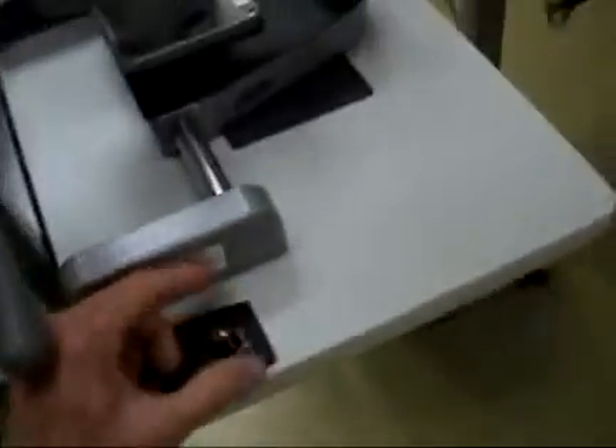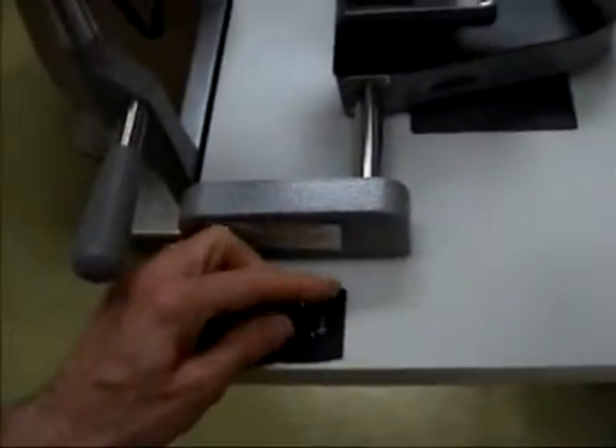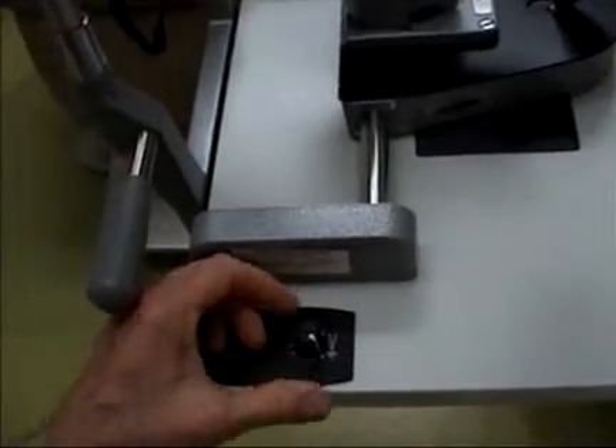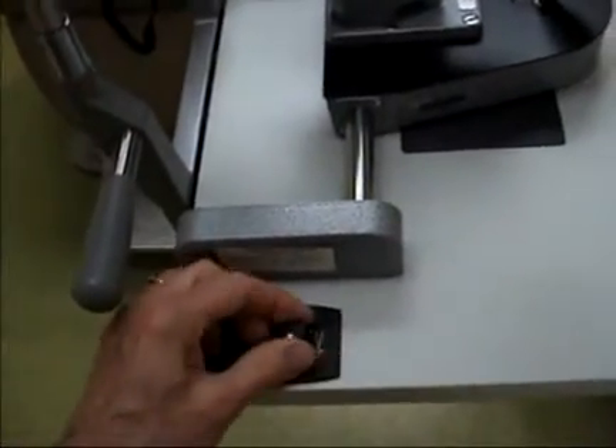It doesn't mean though that it's free from lighting problems. I recently had one of these where the rheostat would not turn on and off and it wouldn't dim. So it wouldn't turn off at the off position and it wouldn't change illumination. And it would intermittently short out.